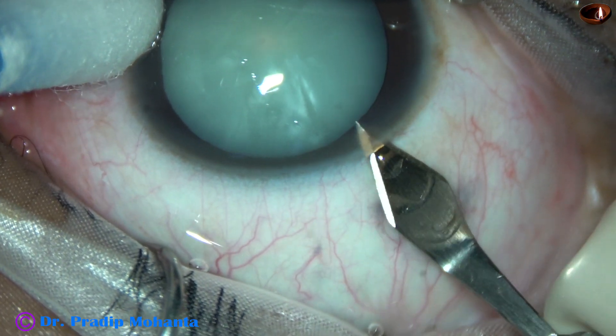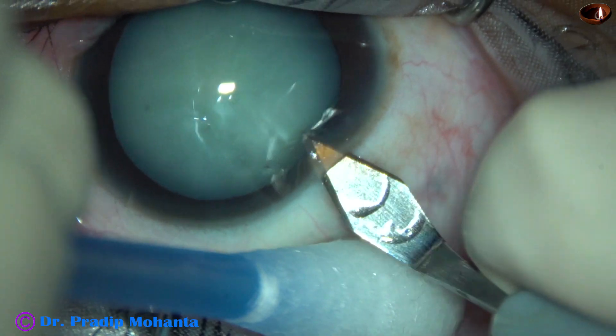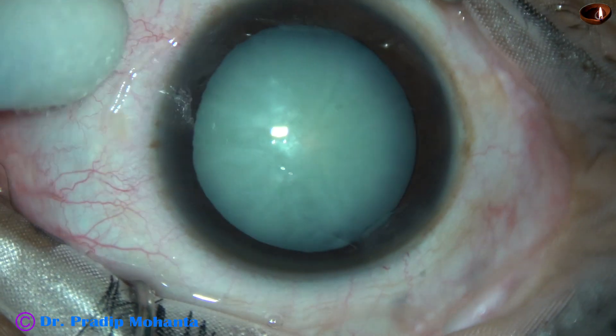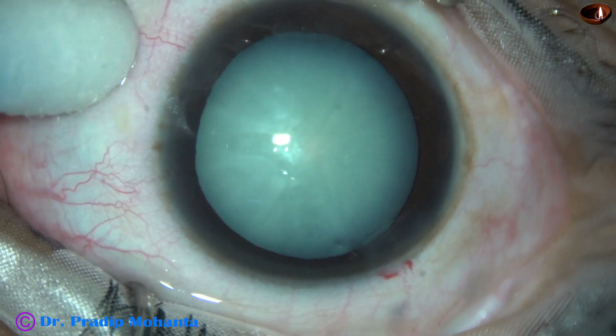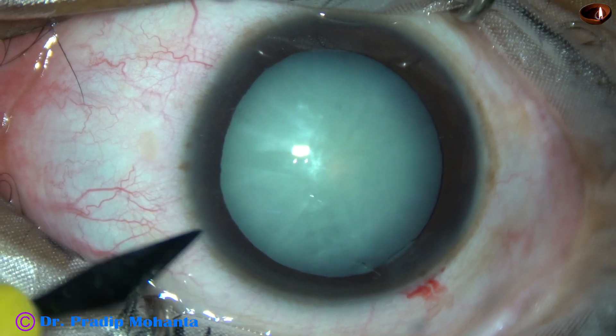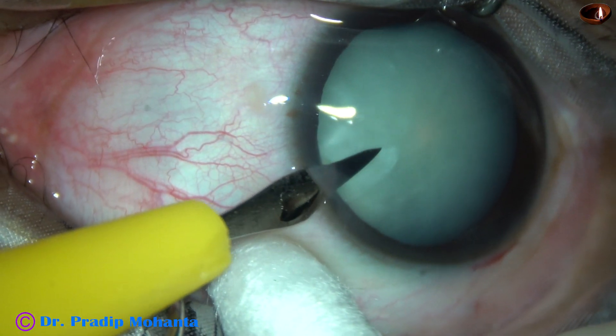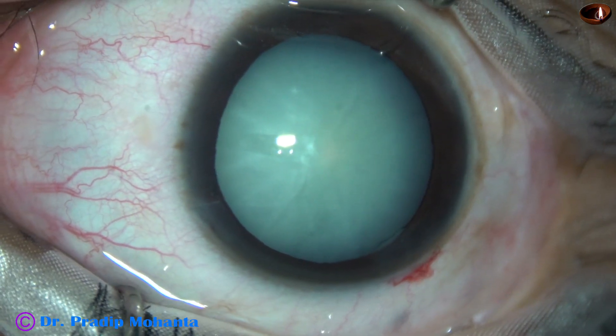This is a mature cataract. The patient is 35 years old and is under peribulbar block. Scleral rigidity is low. I have made a posterior limbal incision and this is a mid-limbal incision.